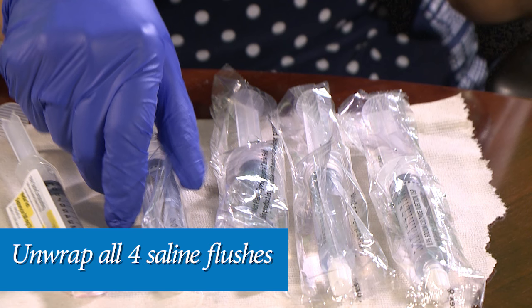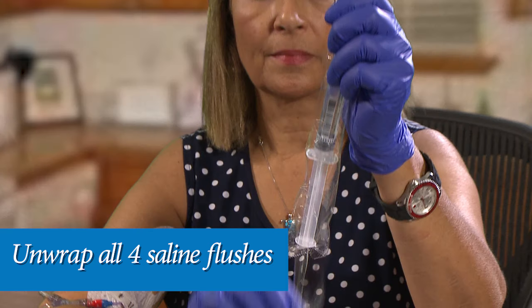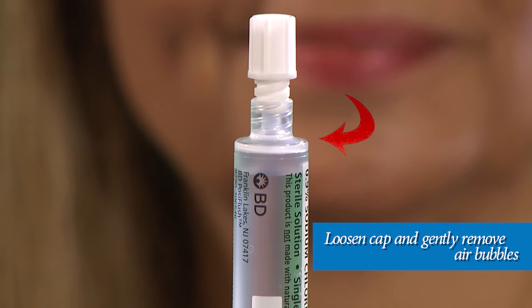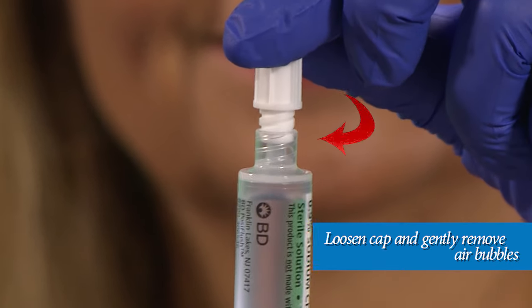Unwrap all four of the saline flush syringes from their plastic wrappers. Now prepare all four saline flushes by loosening the cap on each saline flush and gently pushing the plunger to remove any air bubbles.